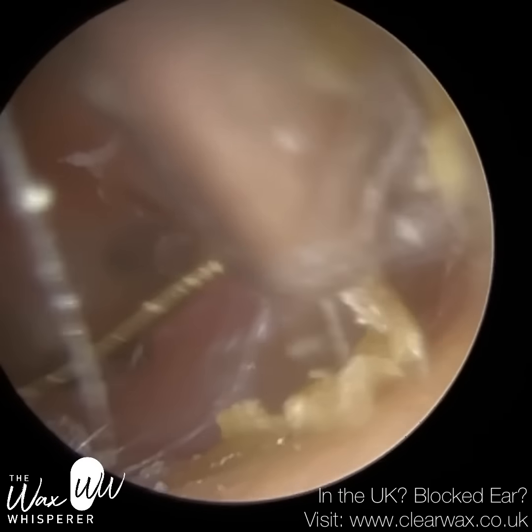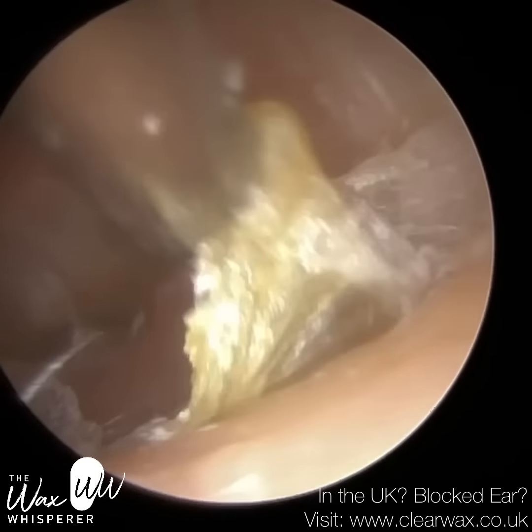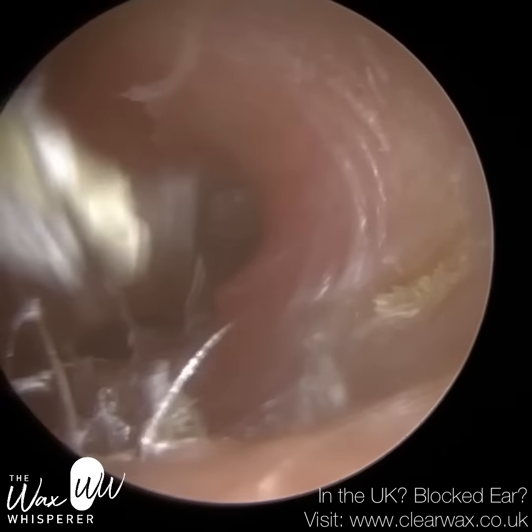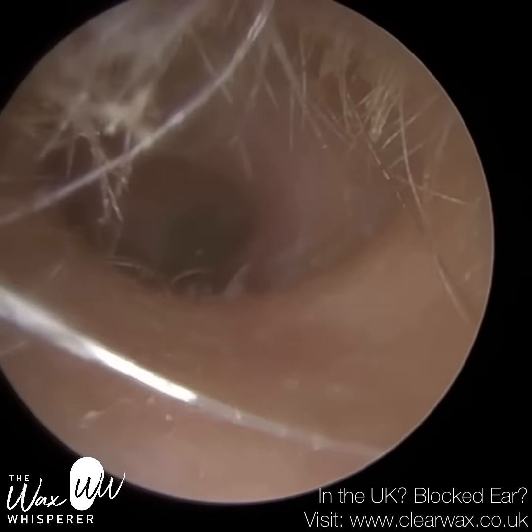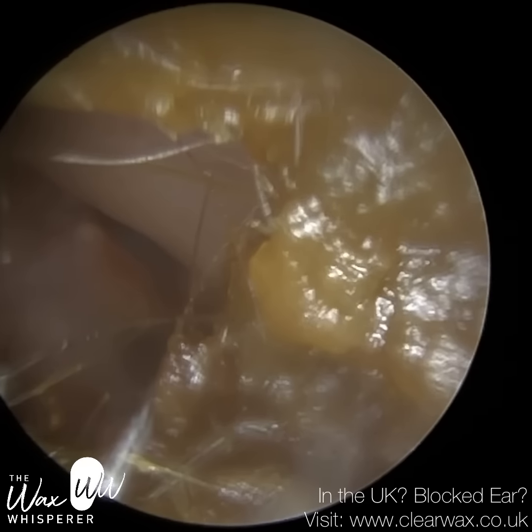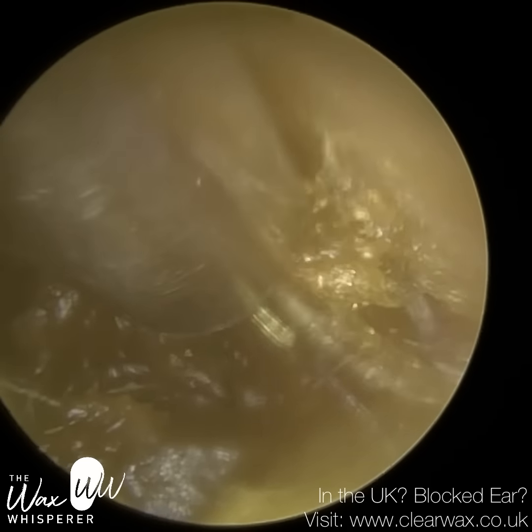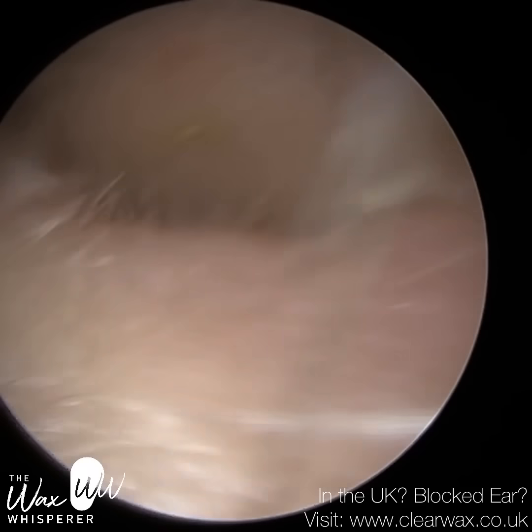That rate of migration is between 1.5 and 3 millimeters a month. It's very similar to the growth of your fingernails, actually. So we've cleared the occlusion, but we've just got this dead skin here. Now, this skin is not going to migrate on its own accord. We have to be careful, whilst we're doing this, not to inflict trauma on the skin that is still adhered to the ear canal, that's not dead and it's not shedding. Because if you damage that skin's protective layer, you can then sometimes cause an infection of the ear canal. So you're going to be really, really careful.